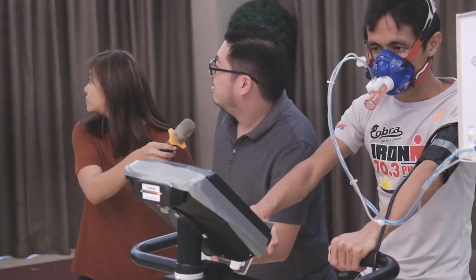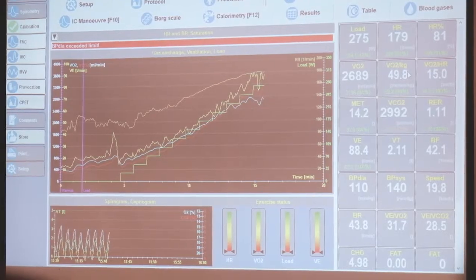Inhale, exhale. Last, sir. Inhale, exhale. Okay, ready? Repeat. Blow hard.